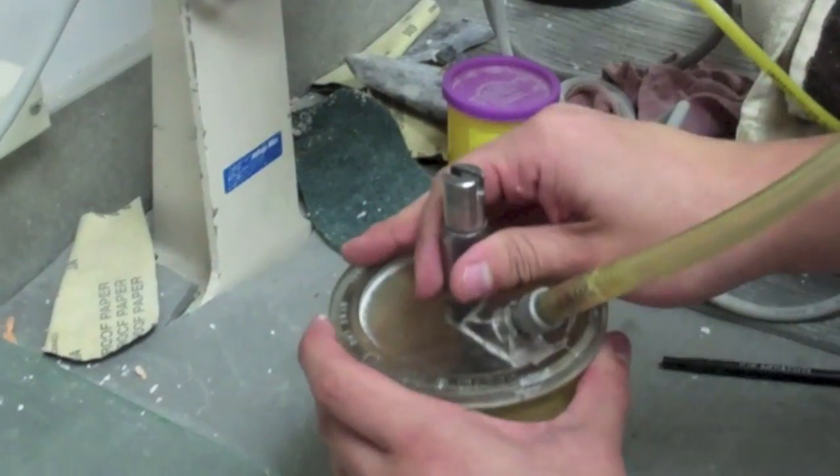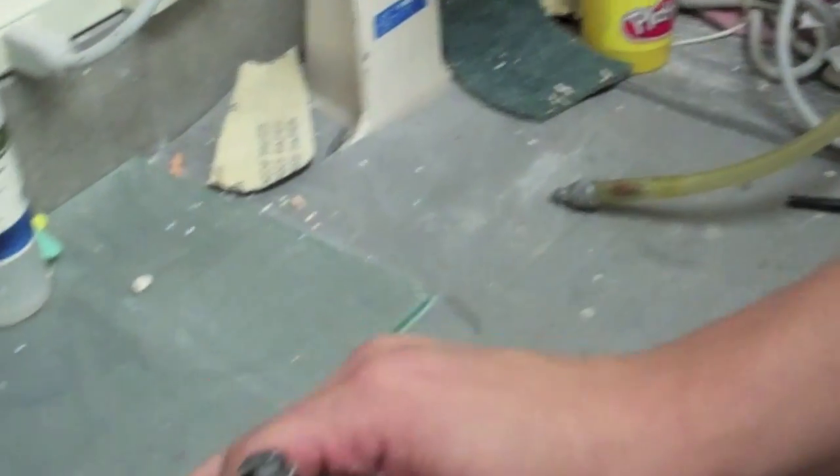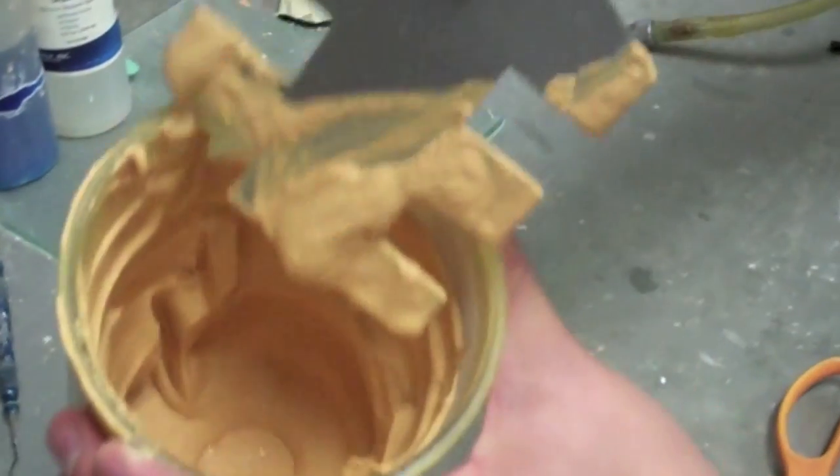Remove the air hose from the insert and open the lid. You should see a creamy consistency as shown.